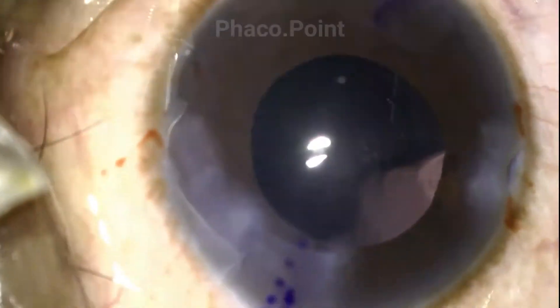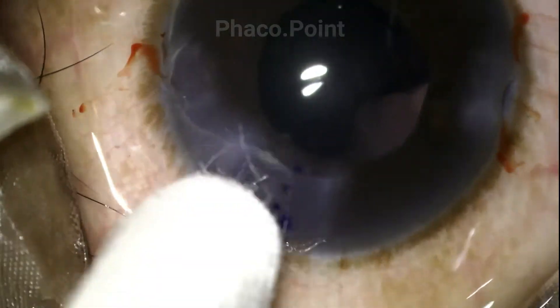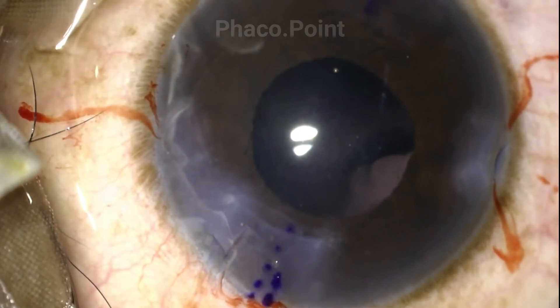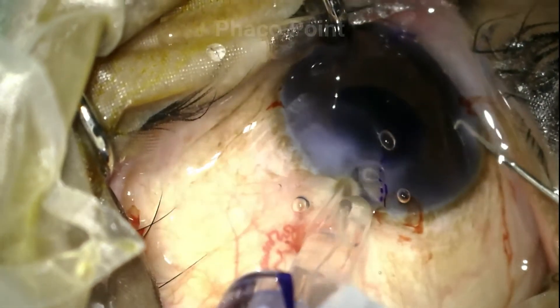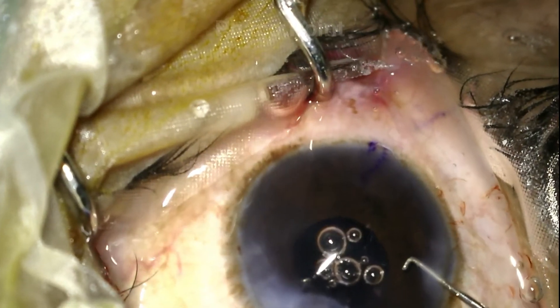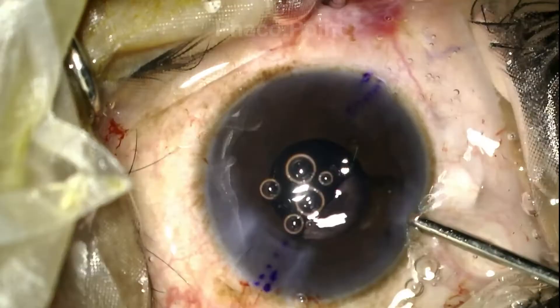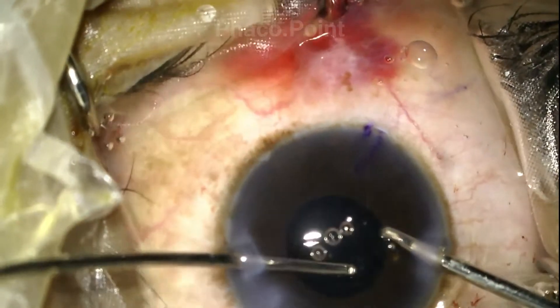Having successfully completed the irrigation aspiration, the doubt now is how this wound is going to behave when we introduce the cartridge to implant the IOL. The surgeon, with care and caution, introduces the nozzle tip into the wound and extremely slowly starts to inject the lens. Following the successful implantation of the IOL, you will notice that there is really no enlargement of the tear in the wound at all.